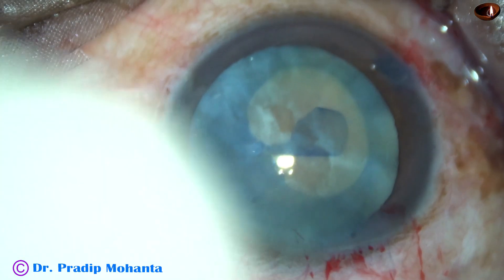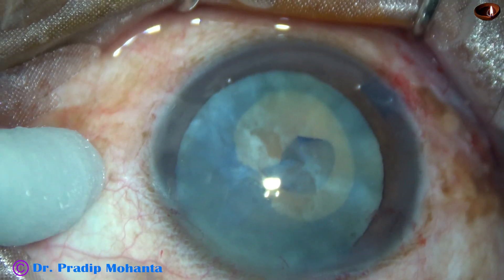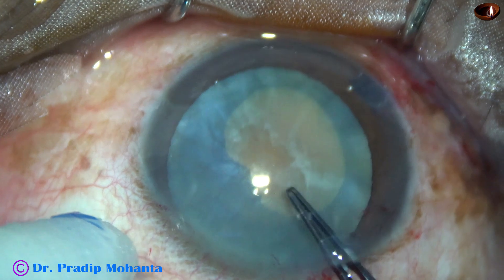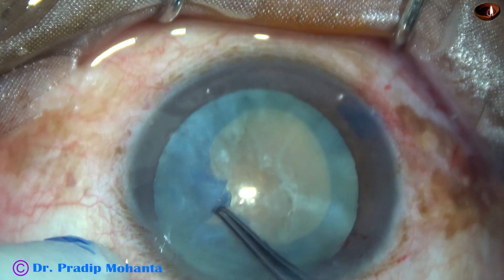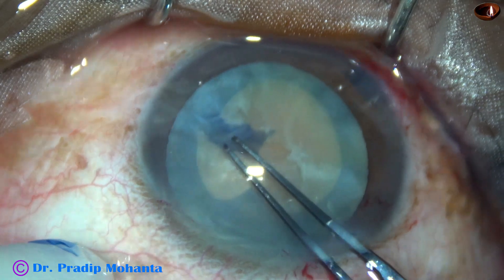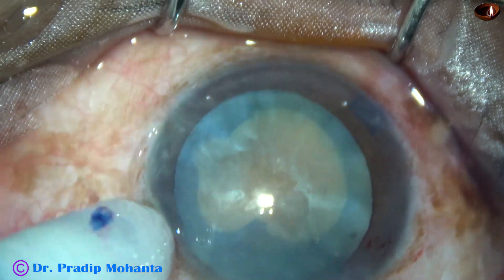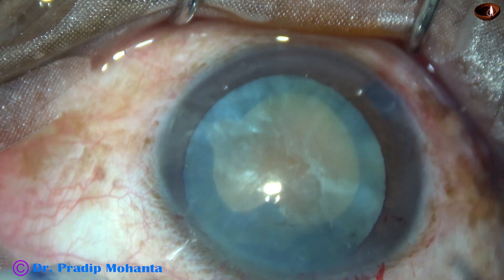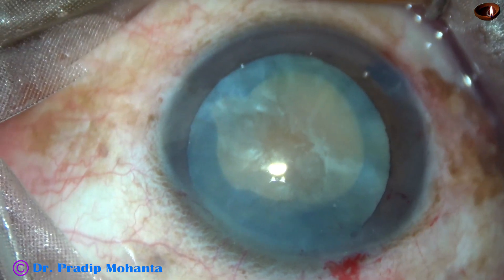Let's inject some more viscoelastic. Now my plan is to separate the fibrous tissue from the anterior capsule. But the anterior capsule has given way. I try to — and I have been able to bring back the anterior capsule. The fibrous tissue is remaining there. I make a nick at this point and make the rhexis okay.